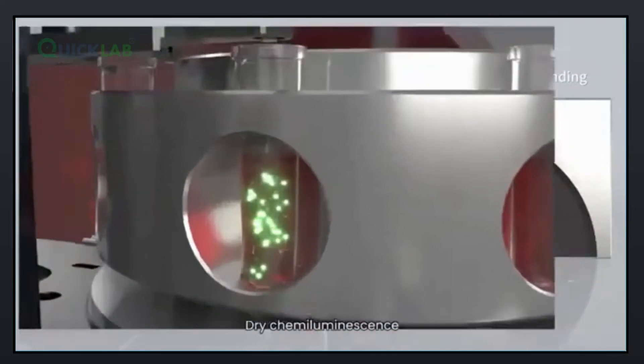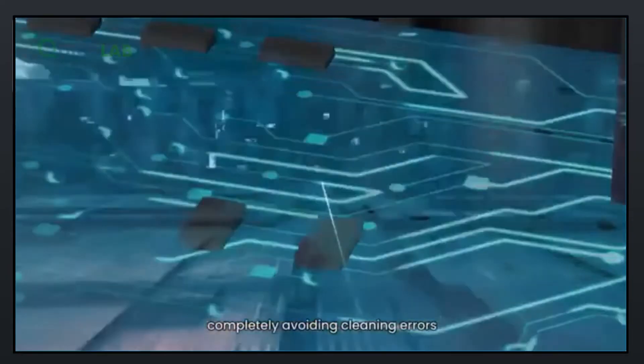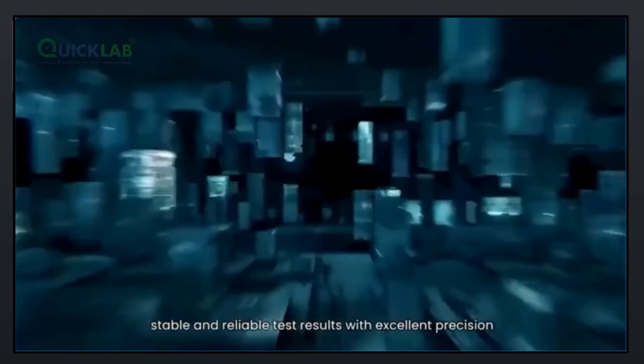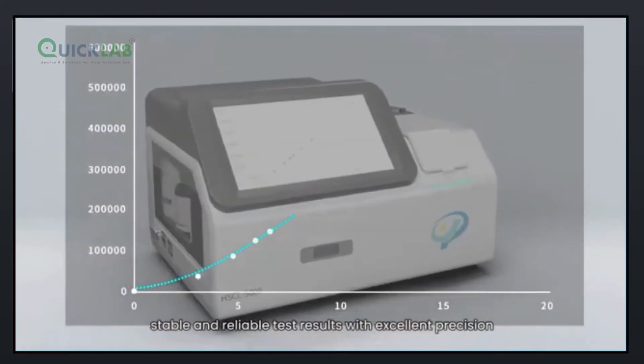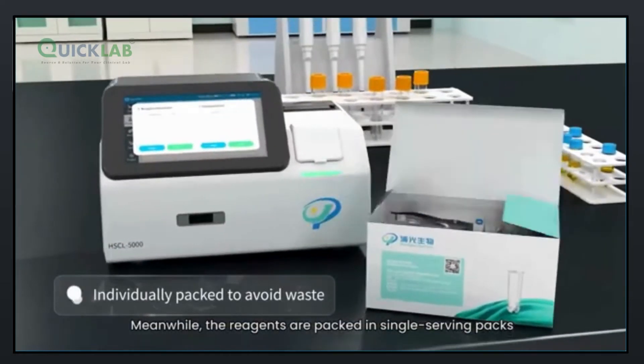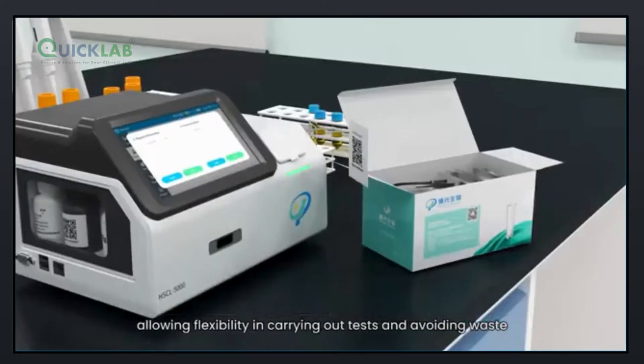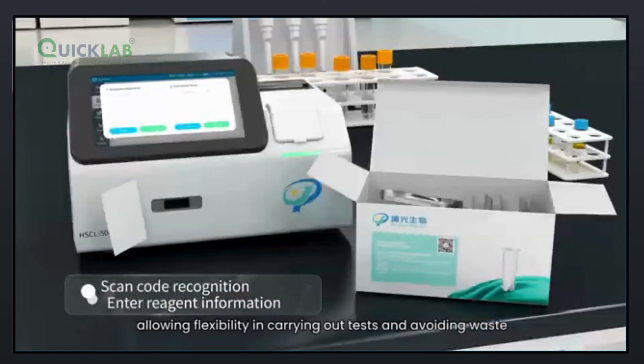Dry chemiluminescence requires no cleaning and no separation, completely avoiding cleaning errors. This delivers stable and reliable test results with excellent precision. The reagents are packed in single-serving packs, allowing flexibility in carrying out tests and avoiding waste.